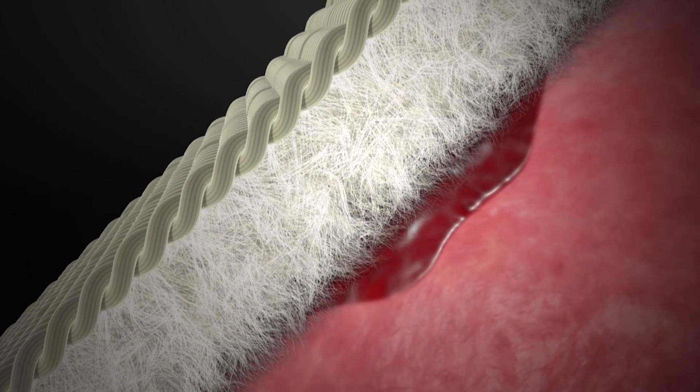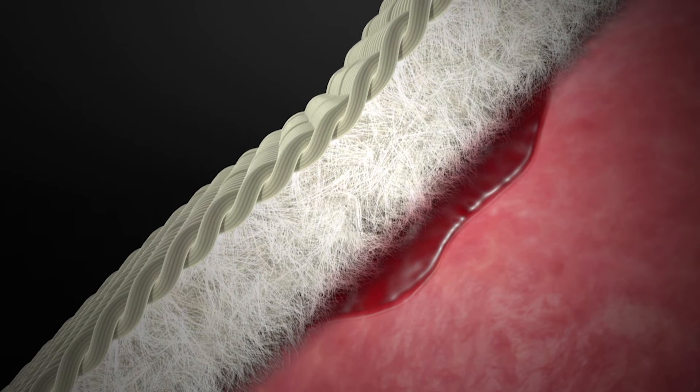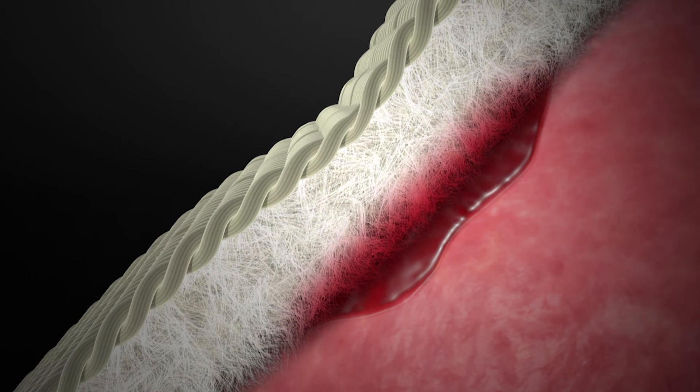To ensure hemostasis, it is important to apply manual compression over the entire surface of the patch.